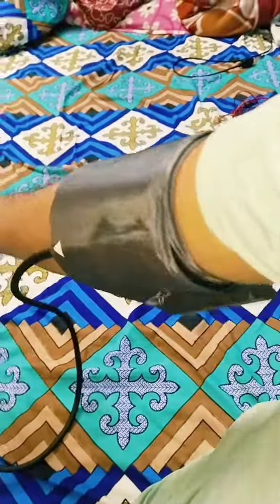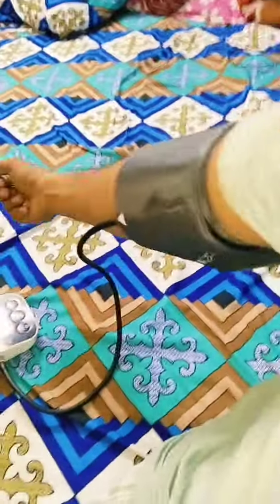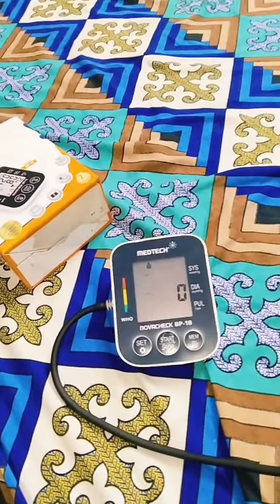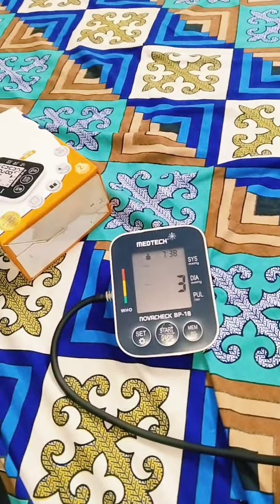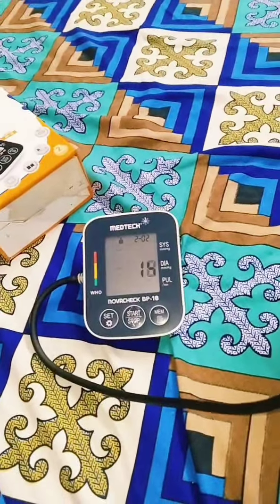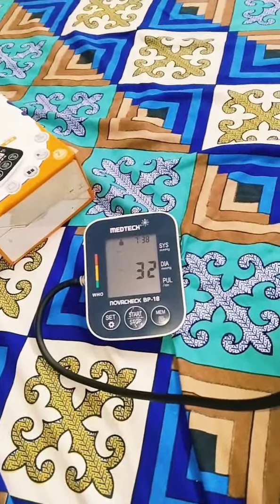I have taken it from this type of blood pressure. I will show you how it is done with the machine. After doing it, it is on. This is automatic. My BP is checking.